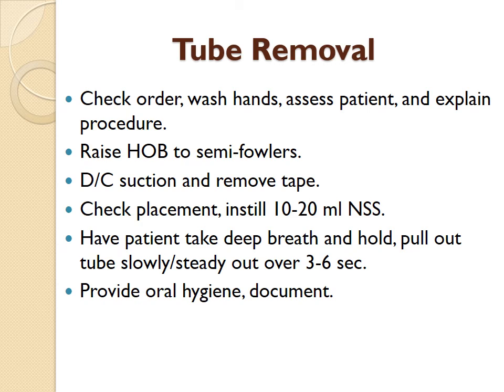You would just turn the dial on that valve to be able to test content or to instill medications, to do whatever's necessary. Once it's secured in place, you make sure the patient is comfortable, and then you're good.